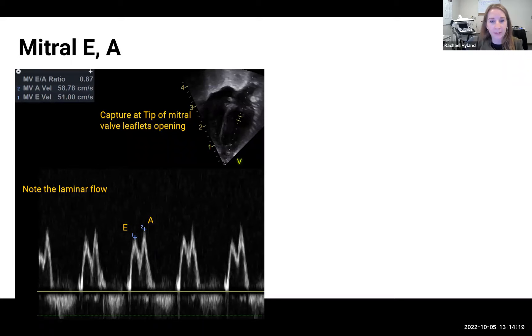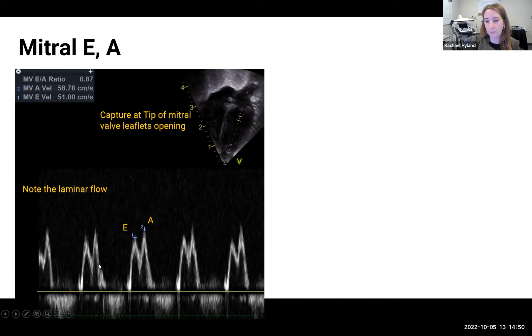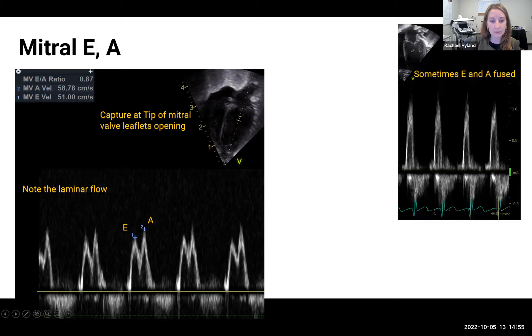Moving on to the mitral valve, we look at LV filling: E for early filling pre-atrial contraction and A for atrial filling. You select peak velocity as you did for the pulmonary S and D. In a typical term baby, E and A are well differentiated. In very preterm babies, you often see a smaller E and larger A, as the premature heart can be quite stiff with less passive early filling — except in those with a hemodynamically significant PDA. Sometimes the mitral E to A can look fused, most often when the baby is tachycardic.